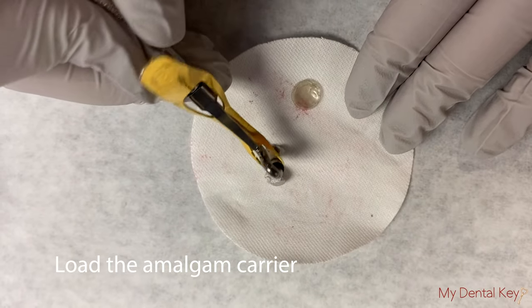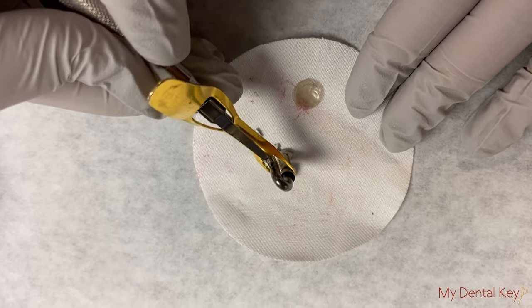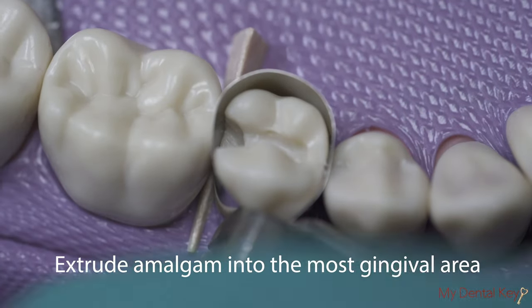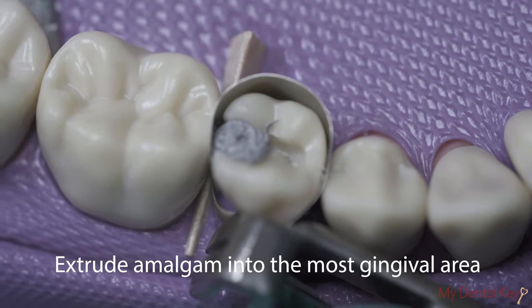Use both sides of the amalgam carrier to pick up the amalgam. Remember, work swiftly with amalgam as it sets fairly quickly. Extrude the amalgam from the amalgam carrier into the most gingival area of the preparation.